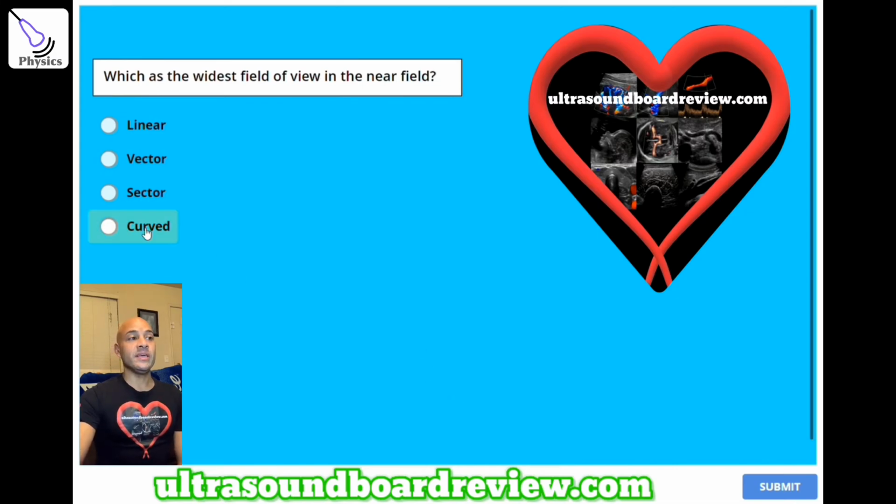The answer is D. Curved. Now, what if this question said, which has the narrowest field of view in the near field? And the answer to that would be sector. A sector will start at a point and will diverge from there, thus making it really narrow in the near field.